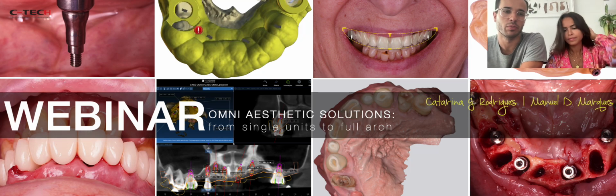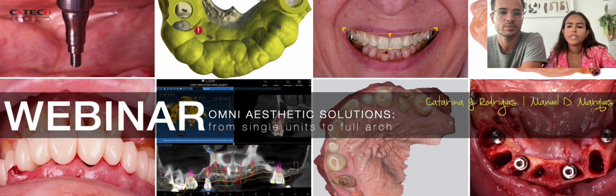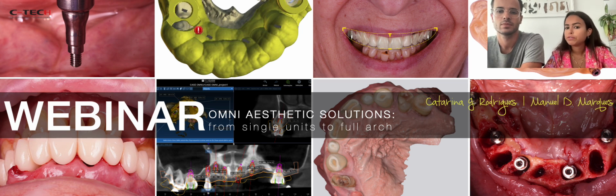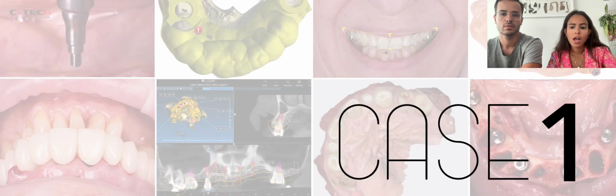We both are from Portugal, and today we will be presenting a webinar that focuses on a very special and new prosthetic component, which is the OMNI abutment. During this lecture, we will show you how you can use it to obtain beautiful aesthetic results on a variety of cases, from single units to full arch. And we will start with a case that shows exactly how versatile the OMNI abutment can be.